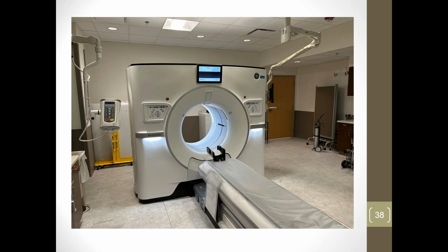And then the doc can call up and say, hey, you need to get the on-call cath lab guys in, like on a weekend or something, or we need to send this guy up to the cath lab. So that's kind of a handy tool because it's non-invasive. They can do a full scan of the heart. They can look for any issues and decide from there if they want to send them to the cath lab or not.